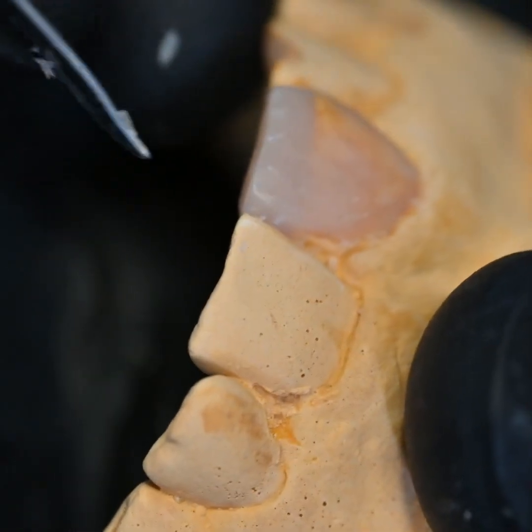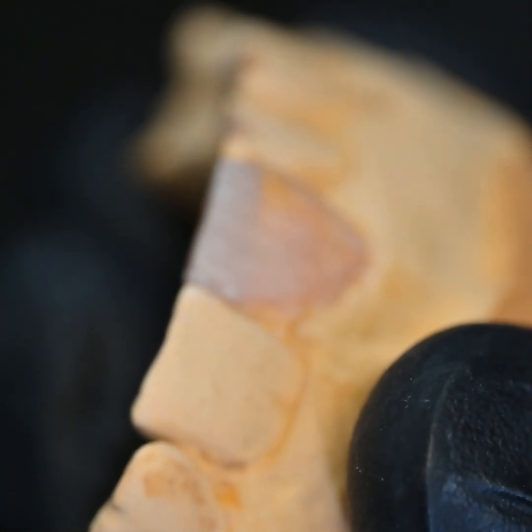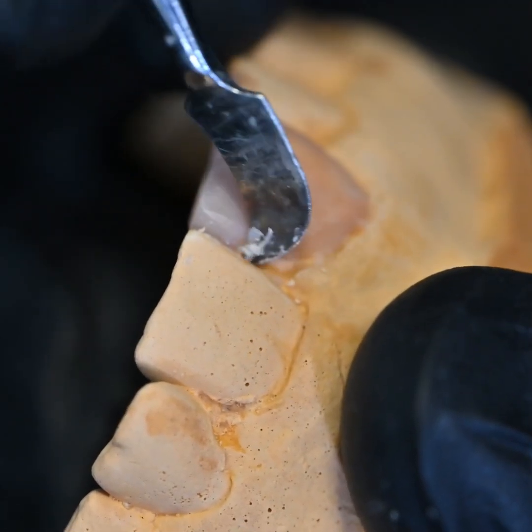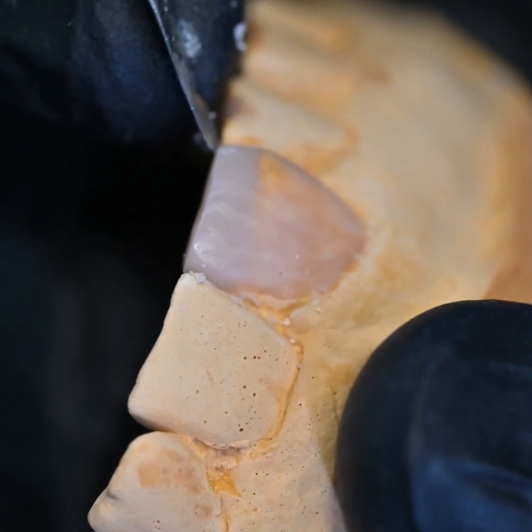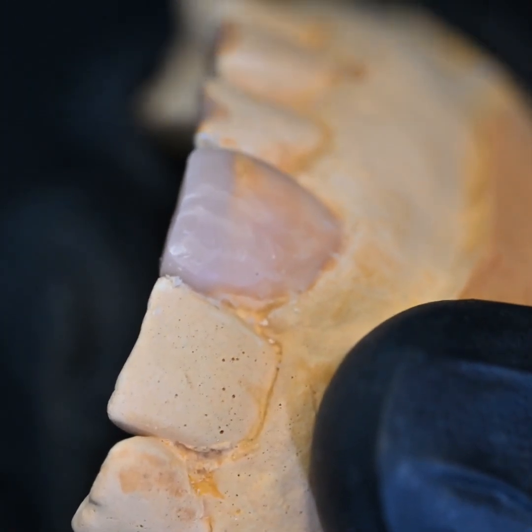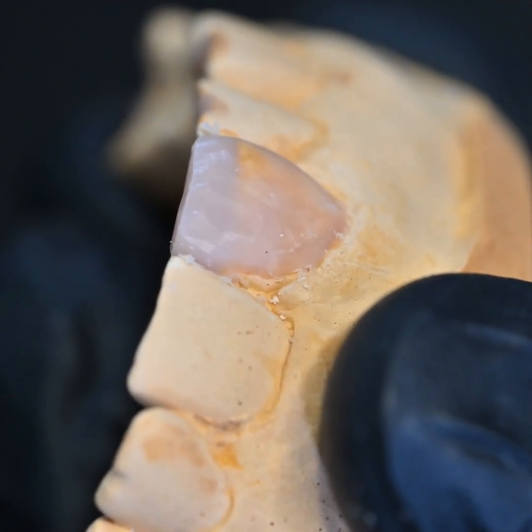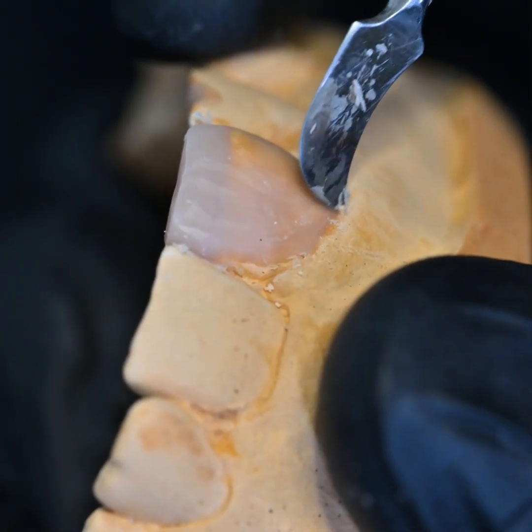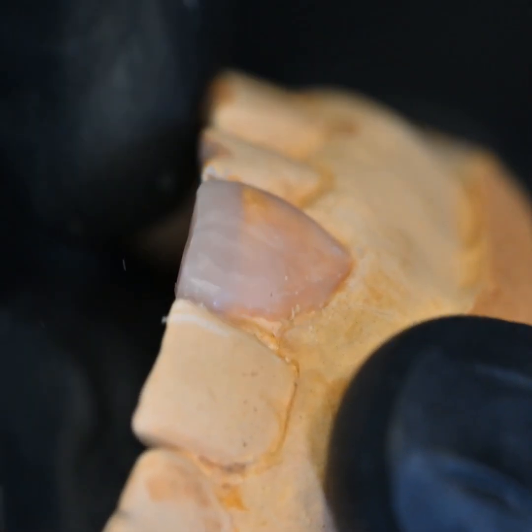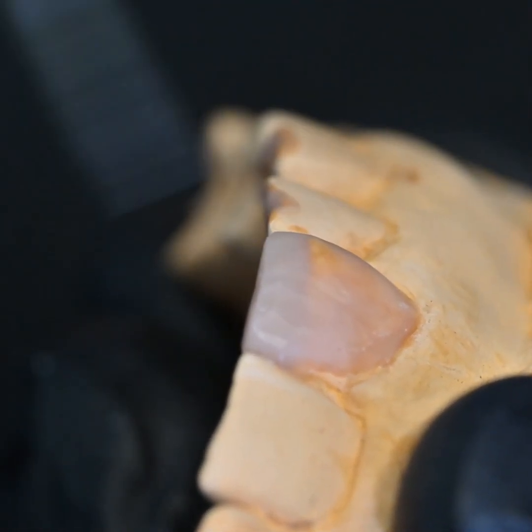Soft, gentle strokes is the way to go about it. Now I'm going inter-dentally, and this is where I will change the carver. The PKT set comes with two kinds of carvers: one looks like our regular Lecron carver, and the other resembles a number 12 BP blade — it's like a sickle shape and really helps us do the places where the regular Lecron does not reach, especially inter-dentally in the embrasures.